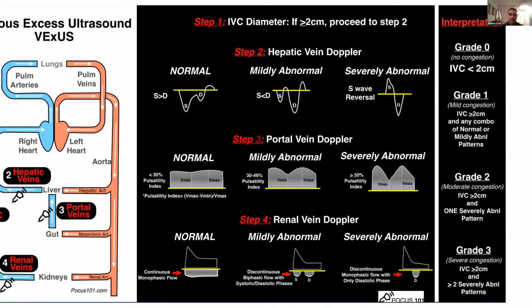This slide's a little cut off, but you can see on the left the venous excess score, or VEXUS. What is that? Let's say you have a 60-year-old patient who is 10 pounds up and having dyspnea. Their baseline creatinine is 1, and now it's about 2. They have evidence of a low FeNa and low urine sodium, consistent with a pre-renal state, and it sounds like this person has a CHF exacerbation with concurrent AKI. Your primary hypothesis at that point might be cardiorenal syndrome.